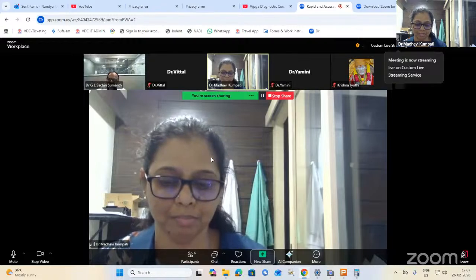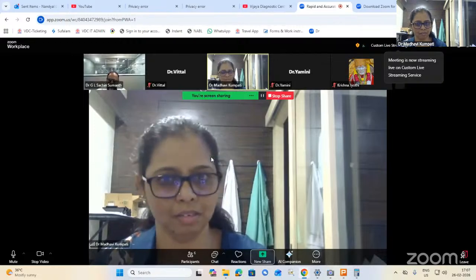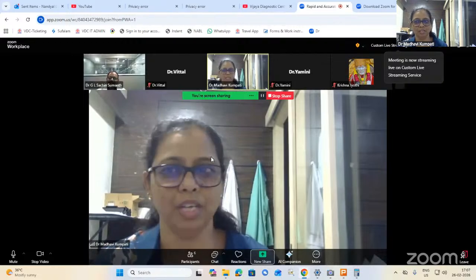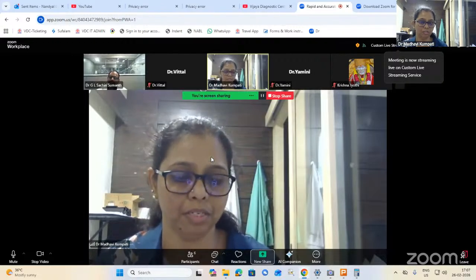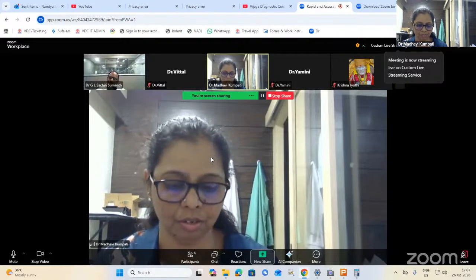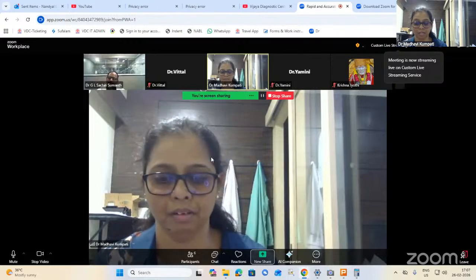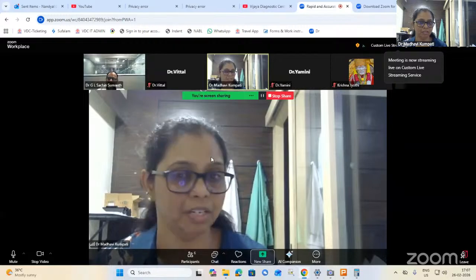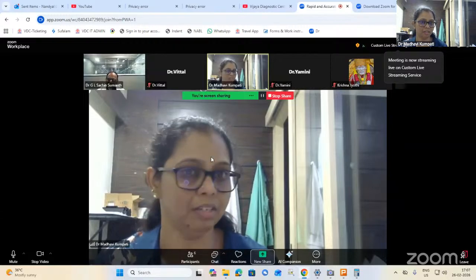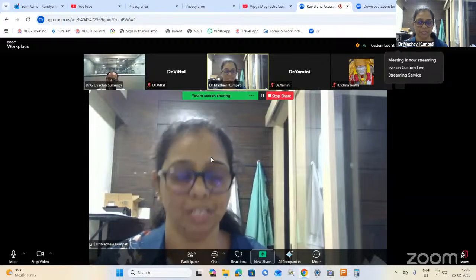One of them is a urine culture which has been collected by a female patient, which is the most problematic thing for me. Probably we don't give our collection procedure properly to the patient, or the patient does not understand. At the end of it, in my plate I'm seeing multiple microbial growth, and then I'm unable to understand whether the patient is actually having an infection, or whether it's contaminant flora, or what's happening.